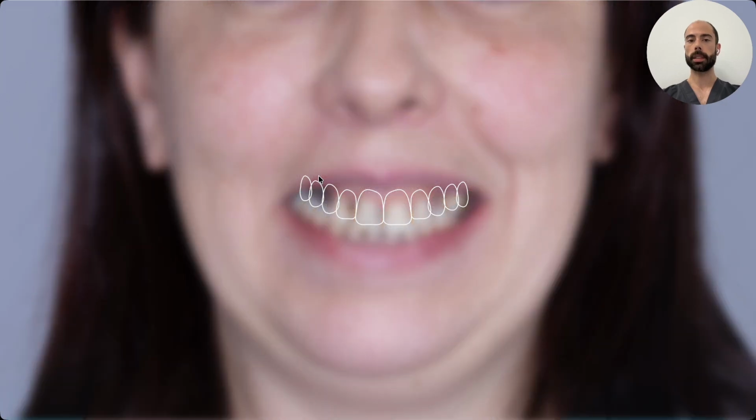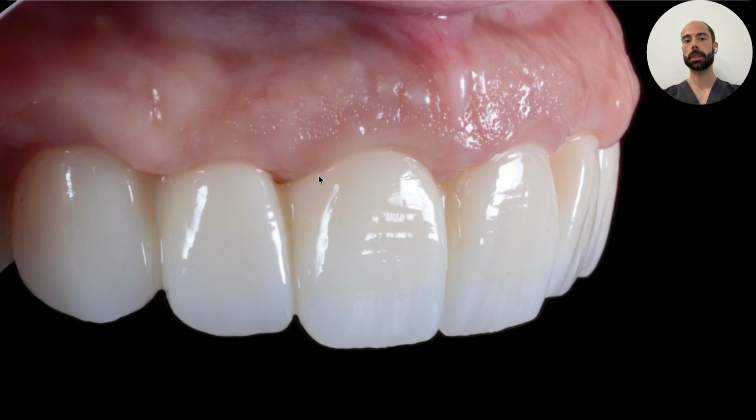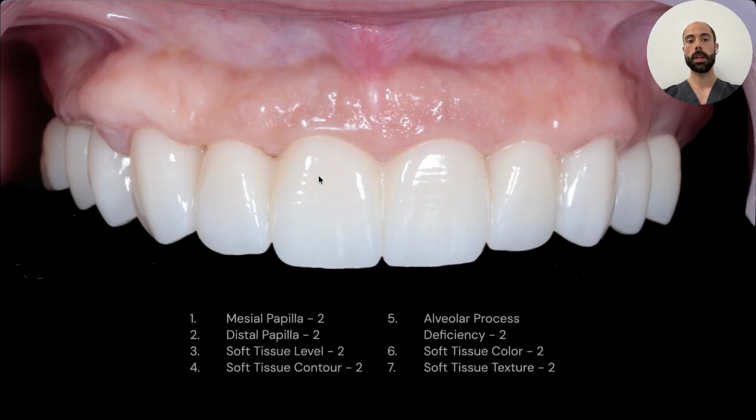This patient went from a failing dentition, hopeless teeth, altered vertical dimension, compromised aesthetics, to a fully rehabilitated arch, FP1, screw retained, maintainable, beautiful. Look how natural is the definitive prosthesis, shapes and color, white aesthetics scored through the roof. Not less important, the natural look of the soft tissue texture and contour. For me, the pink aesthetic score is 14 out of 14.